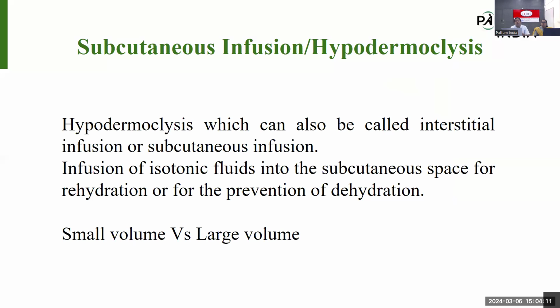What we are doing here is infusion of isotonic fluid into the subcutaneous space for rehydration or for the prevention of dehydration. What do you mean by isotonic fluids?